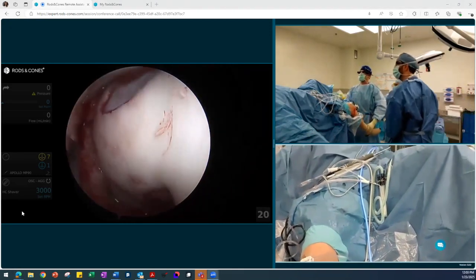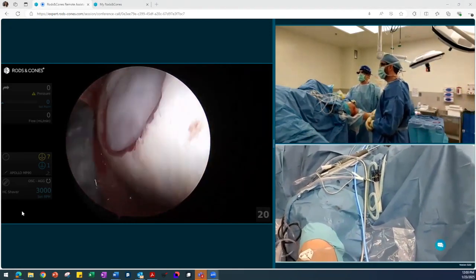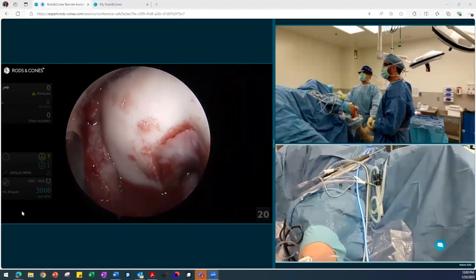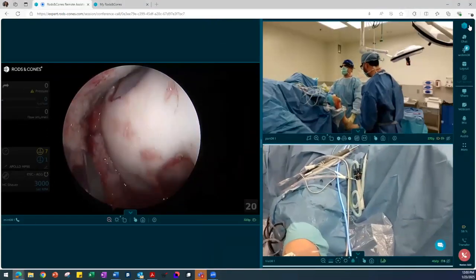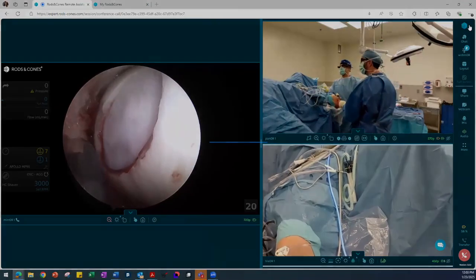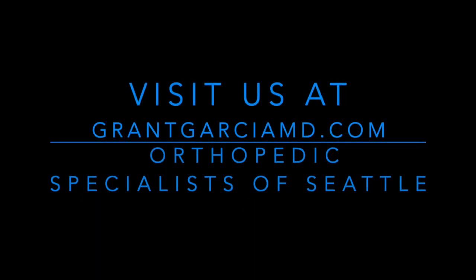Following this, we'll range the knee. You can see here this is similar to an open environment. There is no pulling off of the defect, and the MACI has stayed on without any issues. And again, we're taking it through the 0 to 90 range of motion.